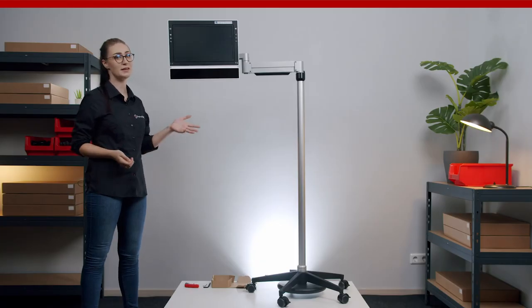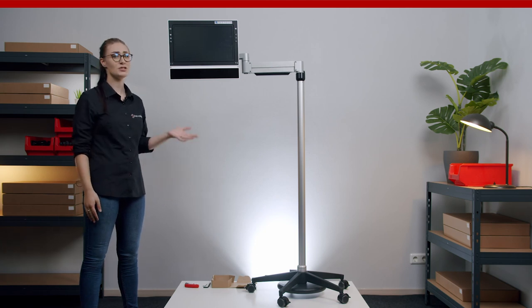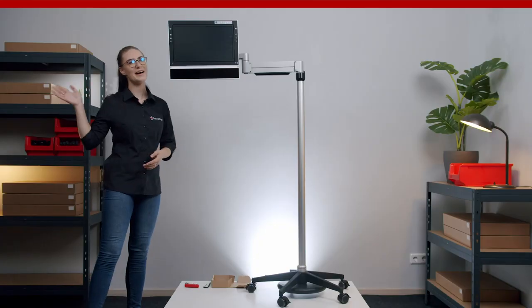I hope you enjoyed this episode of Mounting Made Easy and understood how simple it is to assemble and adjust the Pentafloat Echo floor stand. If you have any questions or suggestions, just leave us a comment down below. I'm Lara from Readapt and until next time, bye!